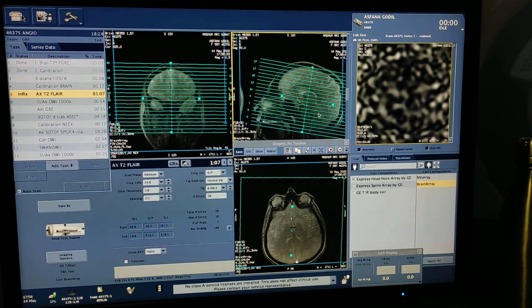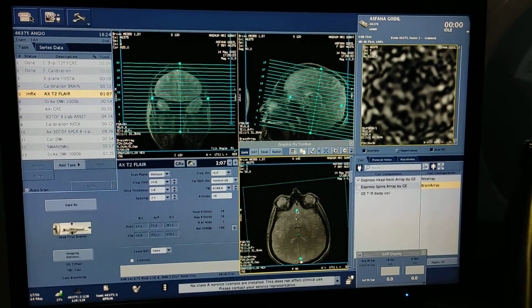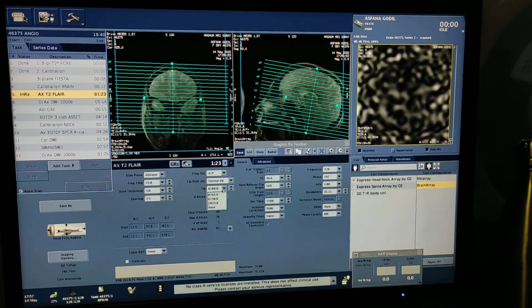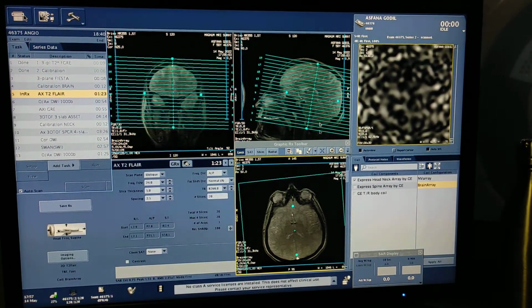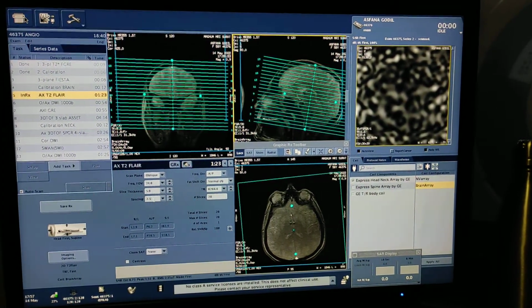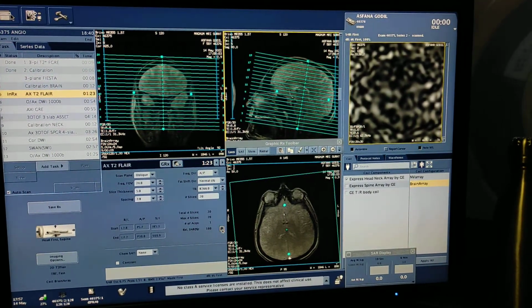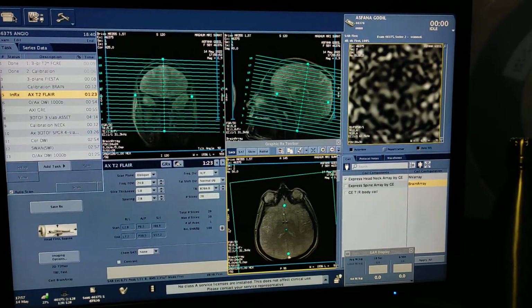I have already posted how to scan brain. You can refer that video. I am not showing it in this video. Simply I have planned this axial. First of all, axial flare.